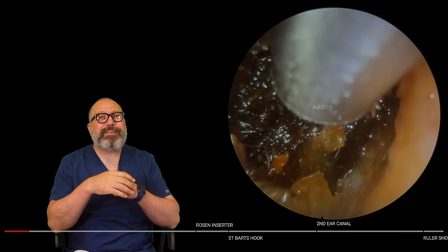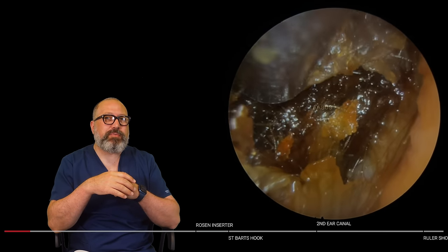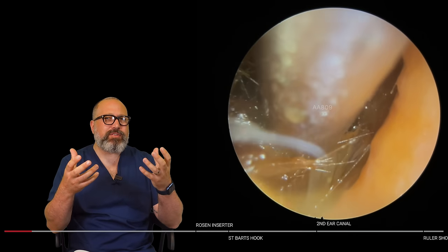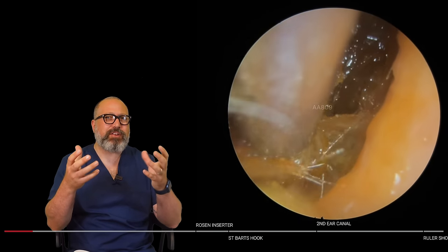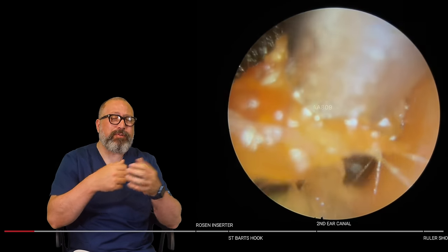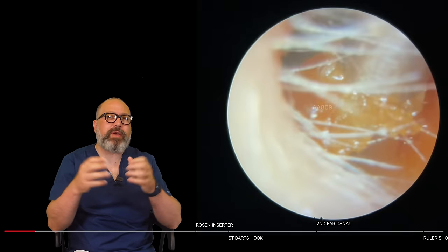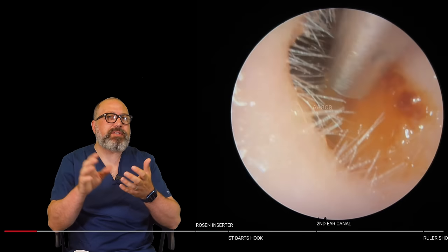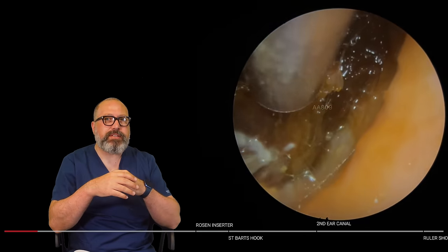All right, so we're coming away now. We can see we've got this long strip of skin. I'm trying to bunch some of the skin and some of the wax together here. You can see everything is just attached. Unfortunately, the wax is dried to the skin, and the skin is still attached to the canal wall, so nothing wants to come away easily here. So it is just a case of very, very slowly taking away piece by piece in this instance.